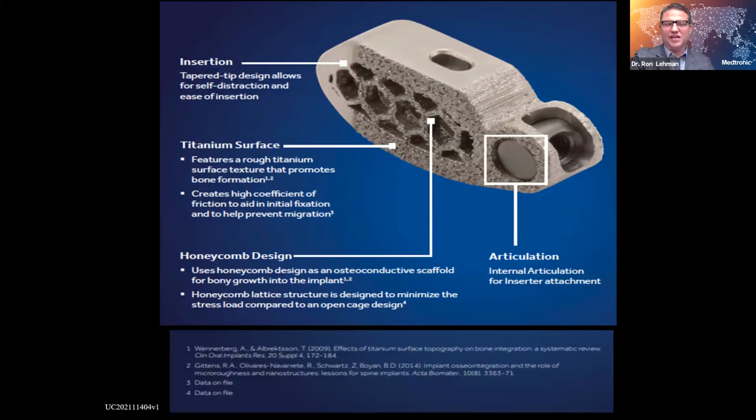And so even with great technique, you can see we can still achieve the lordosis, but now with implants that allow us to get much more angulation, we can do a much better job. And so here's an example of how I do the surgery now, even for an MIS TLIF. This is a 1 level. So once again, Jackie will take a fluoro shot for me.